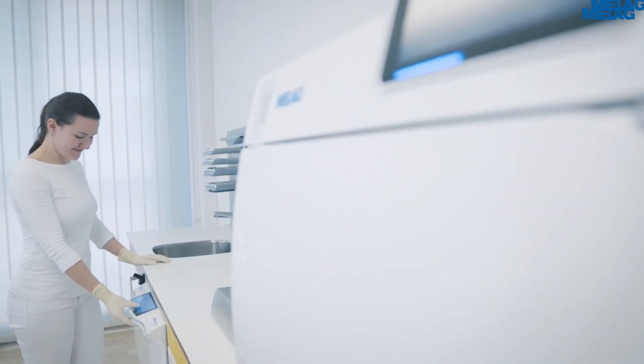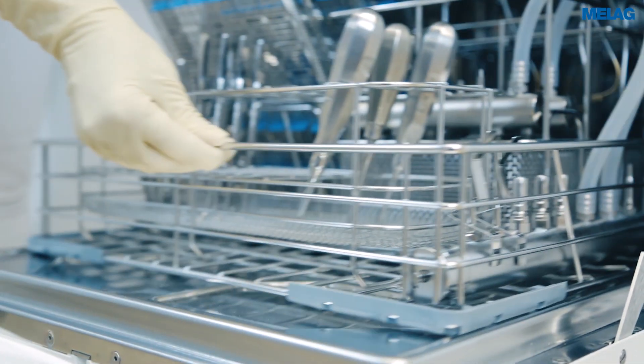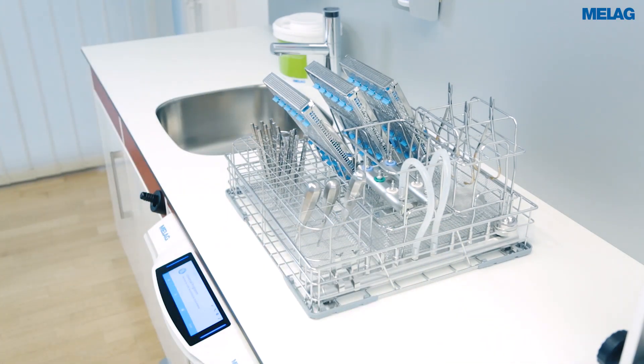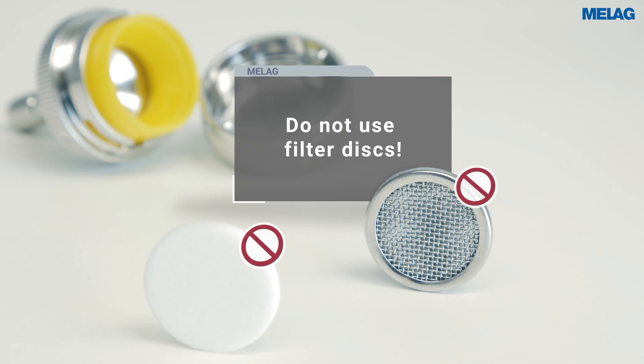The decontamination of hollow body instruments is assuming an ever greater importance in dental clinics. The basis basket with an injector rail and central filter provides a reliable and economical solution. The central filter eliminates the need for further filter disks in the adapters.